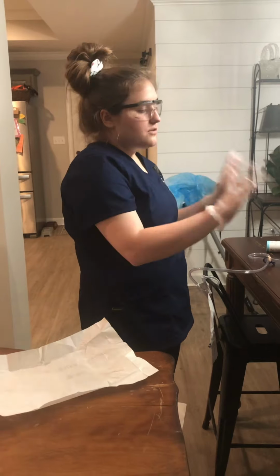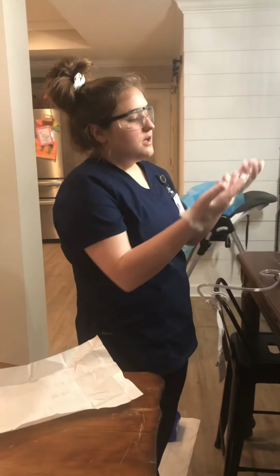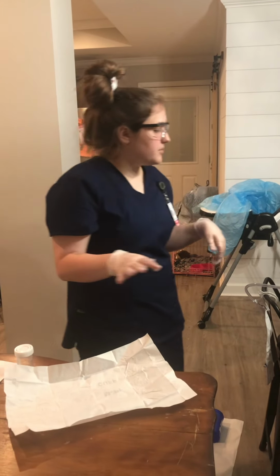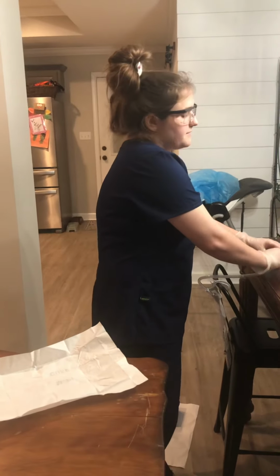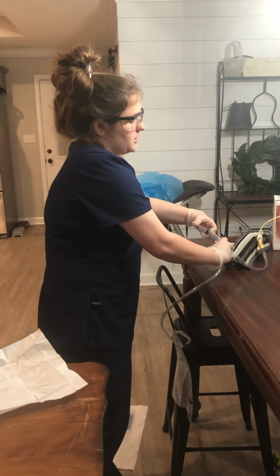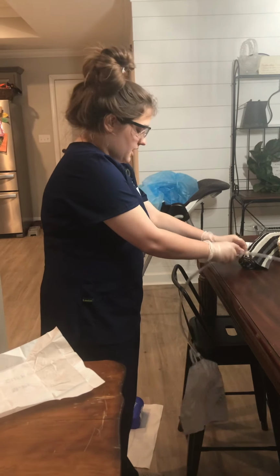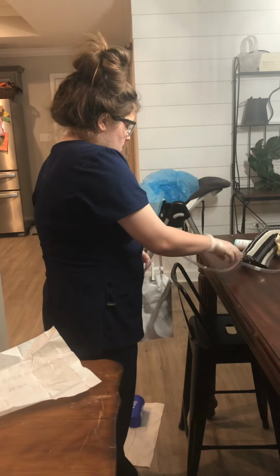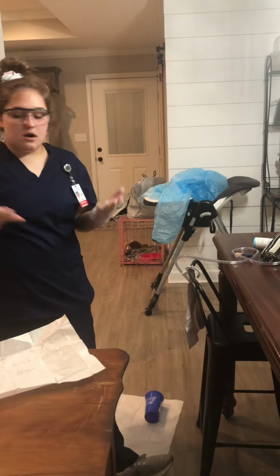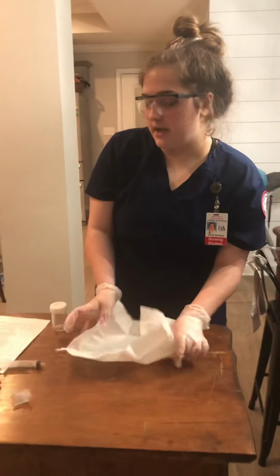So yeah, and then I would lower my bed, raise 3 out of my 4 side rails. I would have my area cleaned up. And then after I collected my sample, I would unclamp the tubing. Okay, and so now I'm gonna show how to discontinue the catheter insertion.